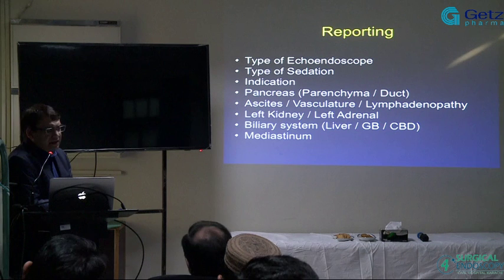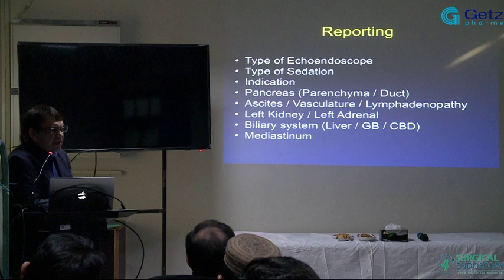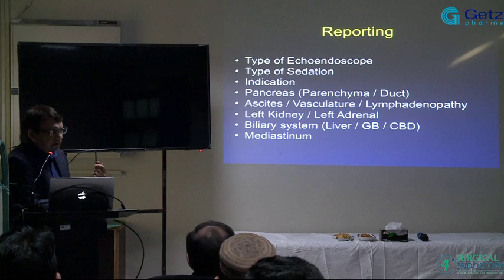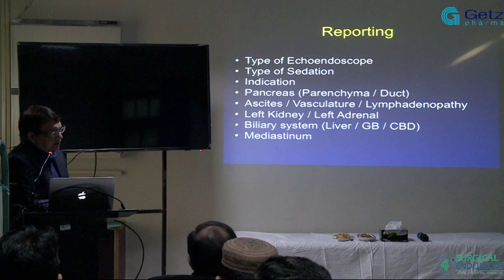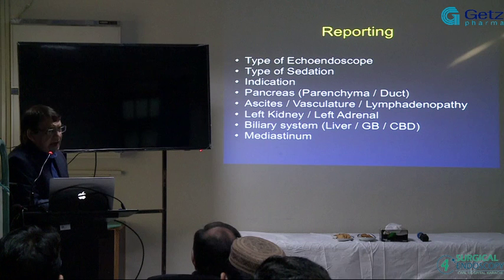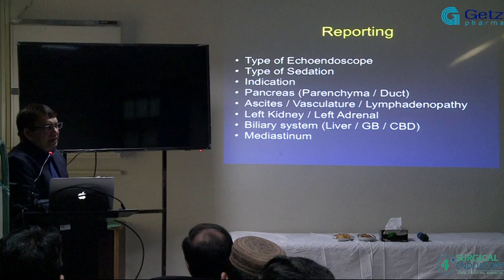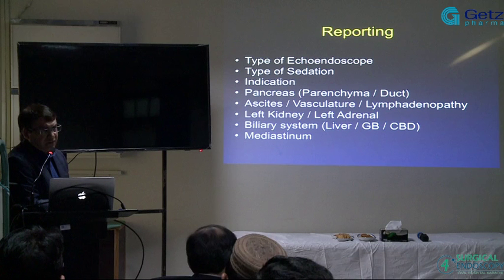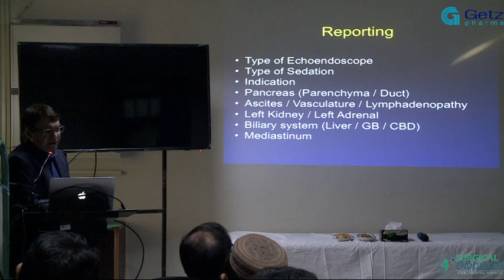So that left kidney, not our specialty. And if you see something really obvious which needs further evaluation, you can mention that. The left adrenal is really important mainly in lung cancer staging, because lung cancer metastasizes to the left adrenal. So in those cases, mention that.